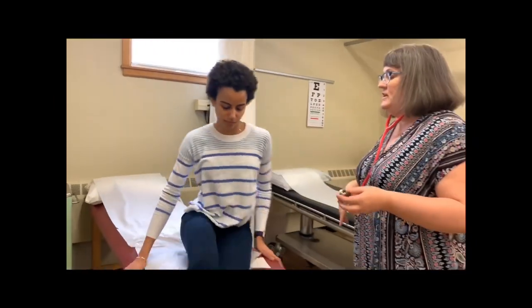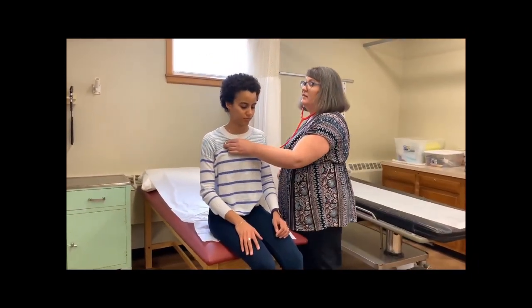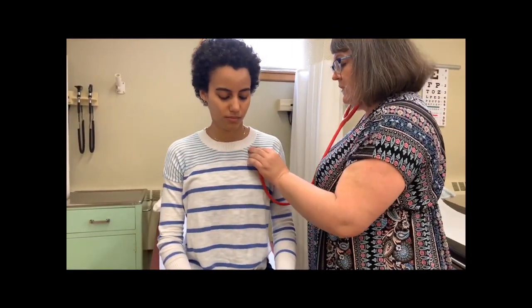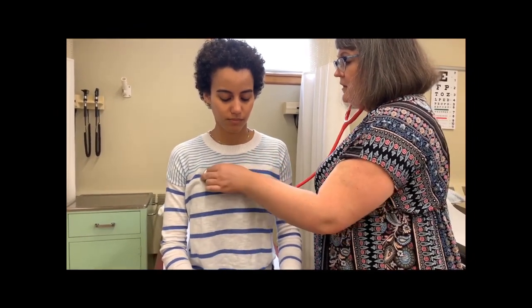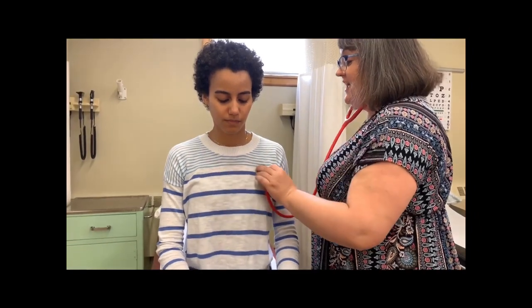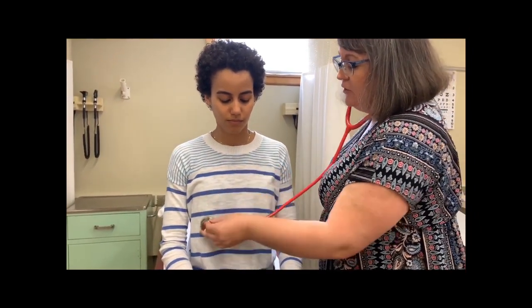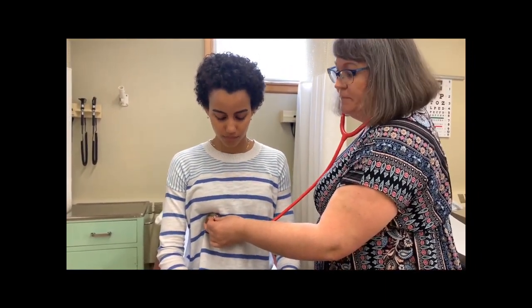So now we're going to do the anterior, and you want to just do the spots just below the clavicle. And it's important to listen to anterior, posterior, and lateral, because if you only listen to posterior, you're only getting lower lobe. And then you've missed out on the anterior, which is mostly upper lobe.